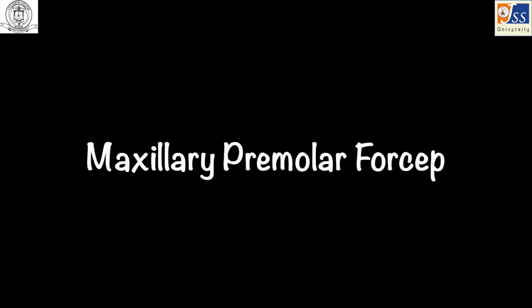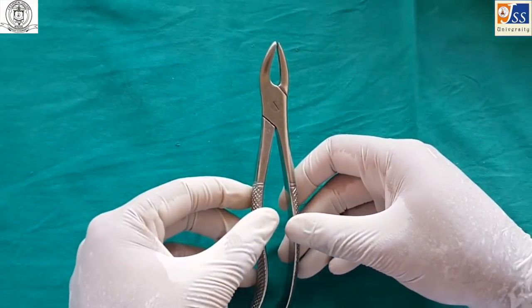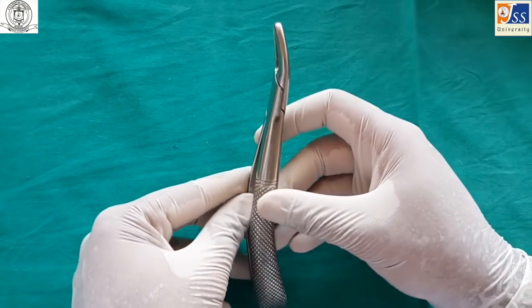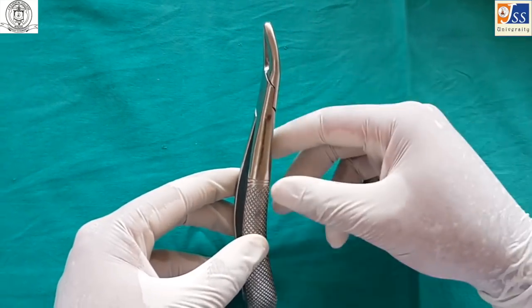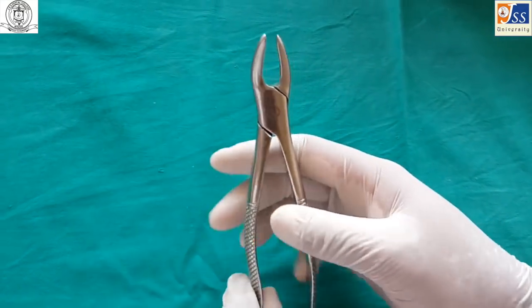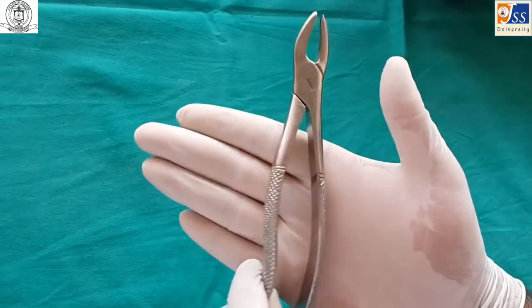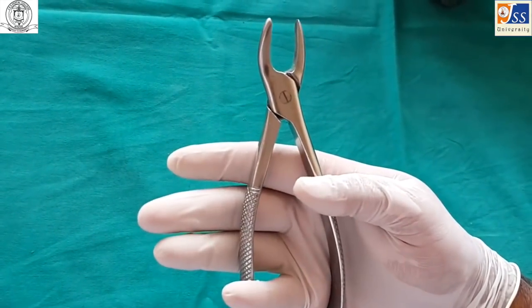The maxillary premolar forceps is used for extraction of maxillary premolars. It is slightly curved, and is held so that the concave part of the handle rests on the palm.